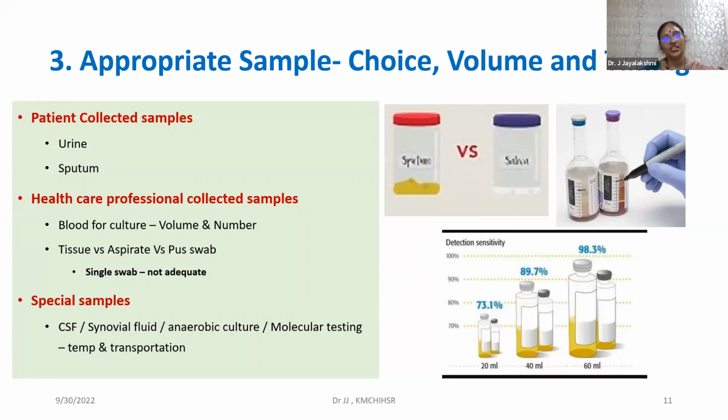Even if the sample is collected well, if it is not transported at appropriate temperatures, again, it's going to be a waste, because CSF samples can have fragile organisms which do not survive cold temperatures. So if you have put them in colder conditions or in the refrigerator accidentally... blood, body fluid, and CSF are never refrigerated.